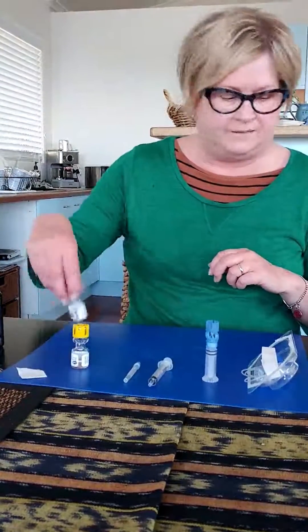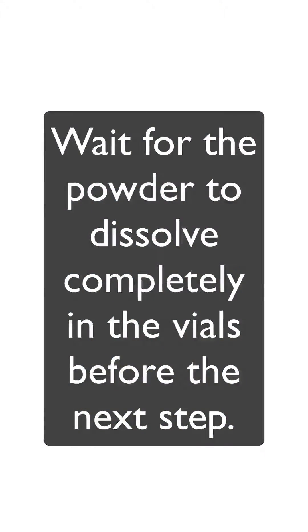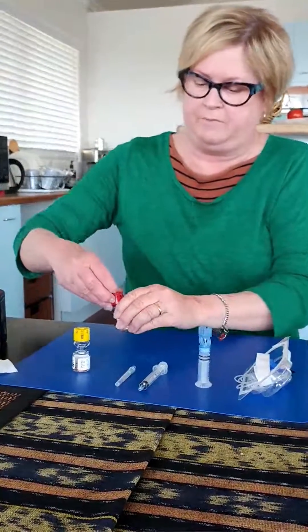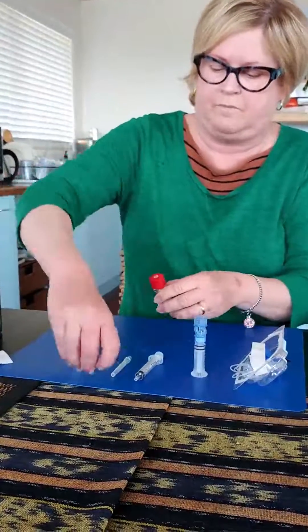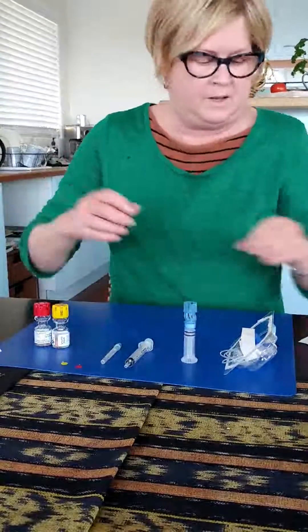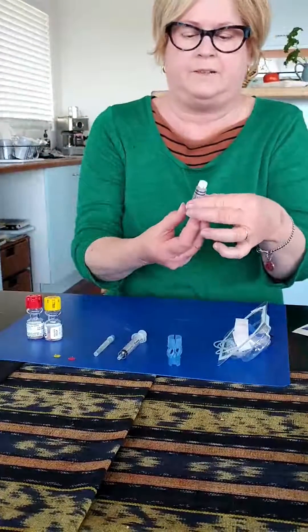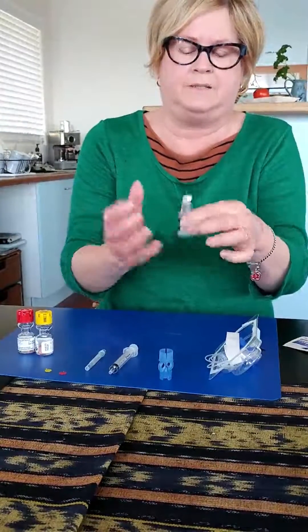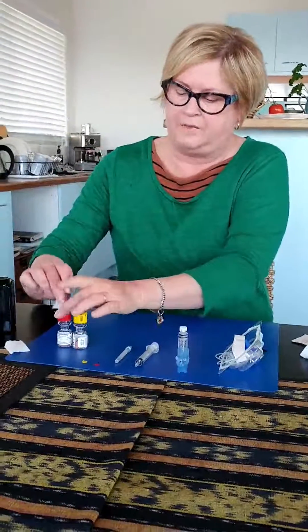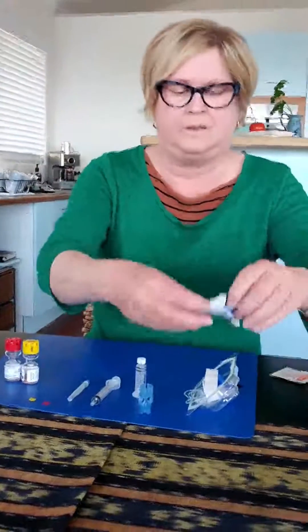The first thing I do is wait for this solution to dissolve. Now both the active valves have dissolved and I just take the little caps off at the top of the reservoir on both of those, and I take the little needle off the top of the reservoir. Just loosen the bottom of that just a little bit, just till it's loose. Now I'm going to alcohol wipe and I wipe the top of my active valve — sterile — and I wipe the top of my reservoir.